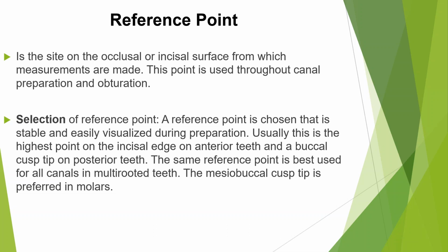For anterior teeth, this is usually the highest point on the incisal edge. For posterior teeth, this is usually a buccal cusp tip. And then the same goes for all canals in multi-rooted teeth. And then the MB or mesiobuccal cusp tip is preferred in molars.